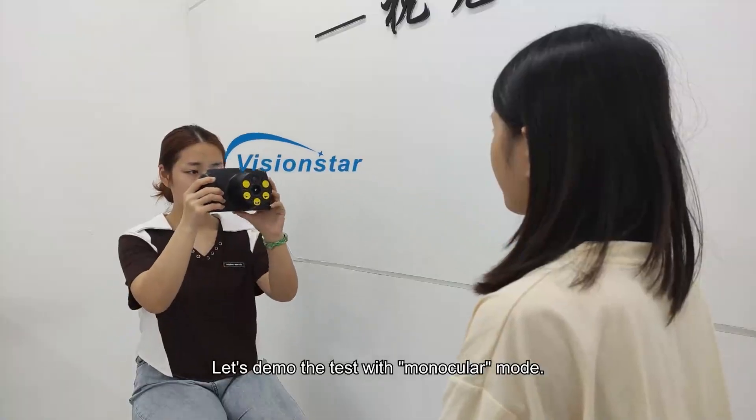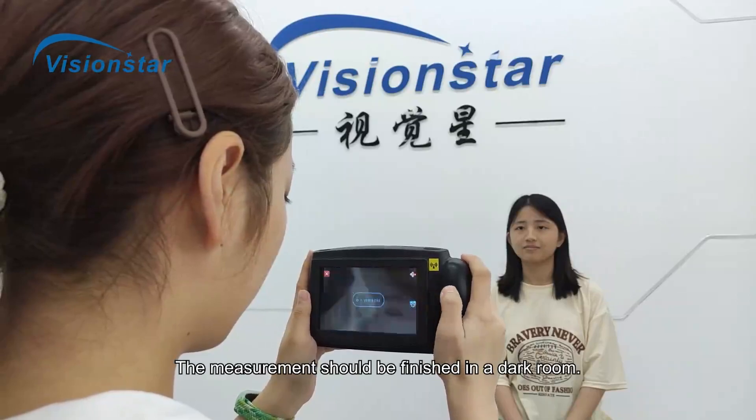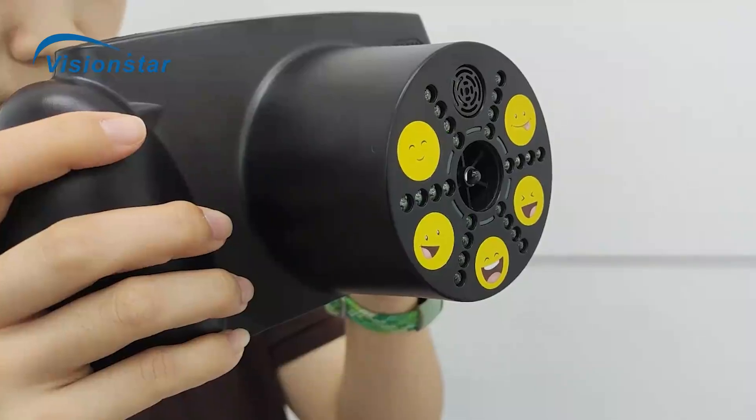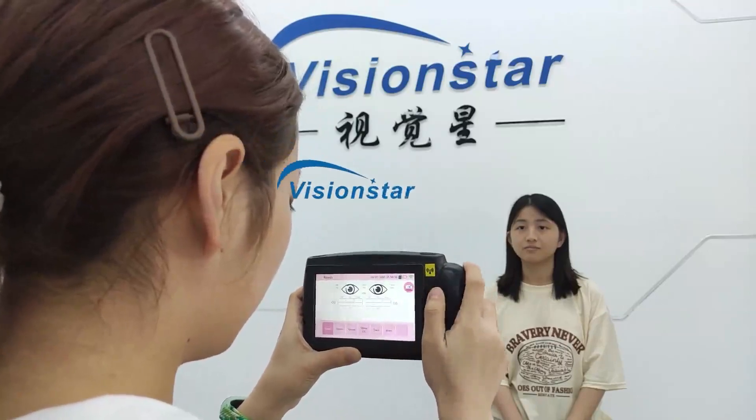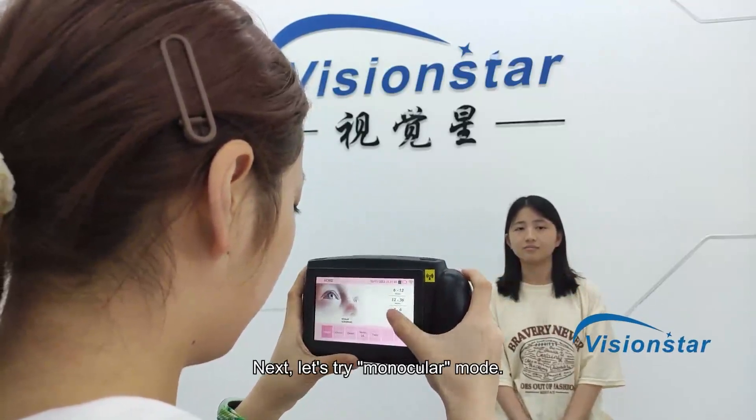Let's demo the test with monocular mode. The measurement should be finished in a dark room. Next, let's try monocular mode.